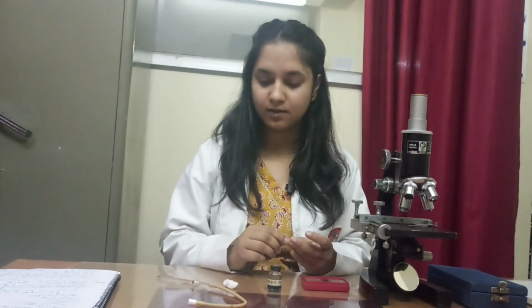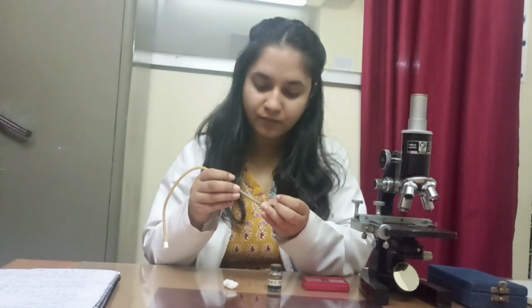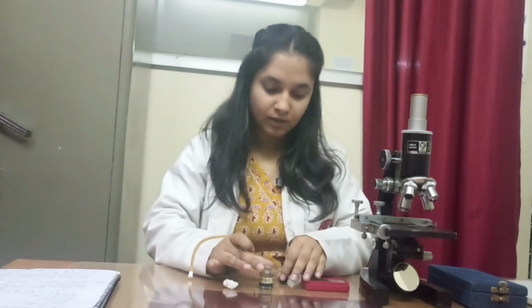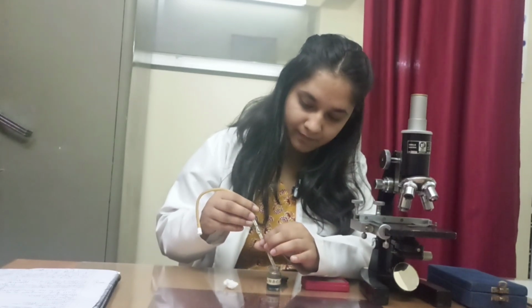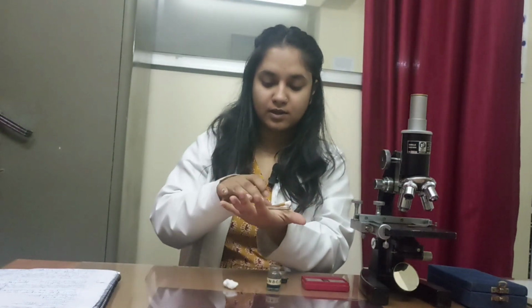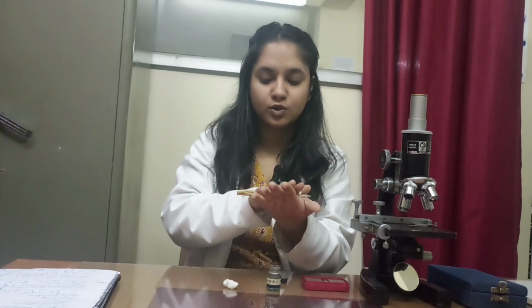First we prick our finger. After pricking the finger, we should take blood up to the 0.5 mark. After that, we take Turk's fluid up to the 11 mark. After taking the fluid, we mix this fluid and the blood in a proper proportion so that the fluid and blood mix.